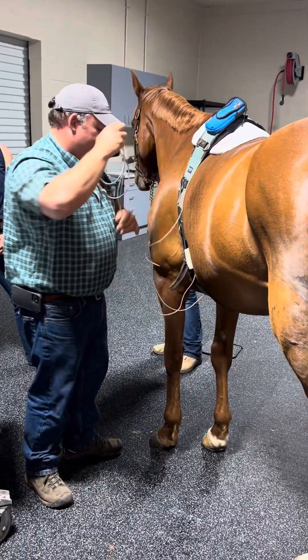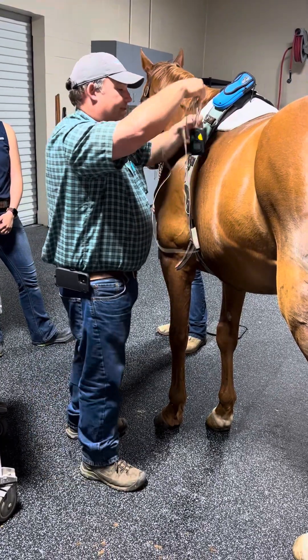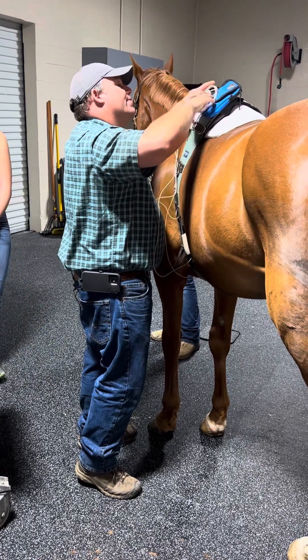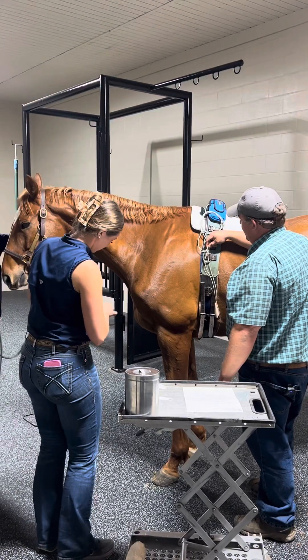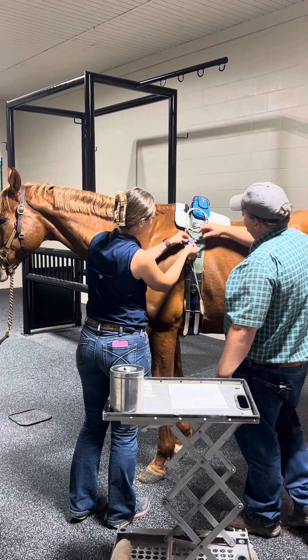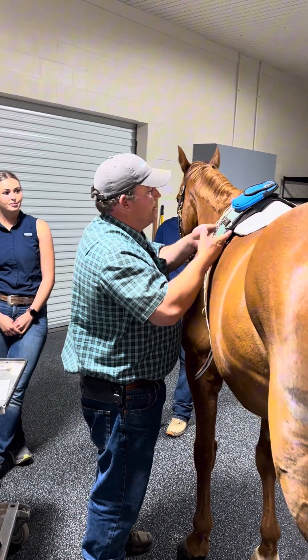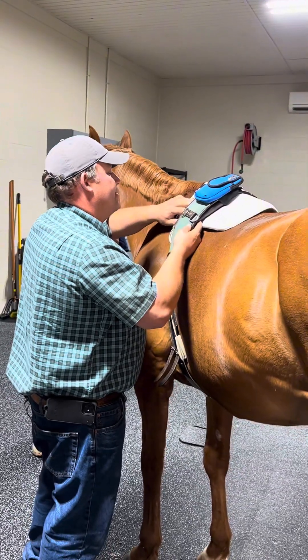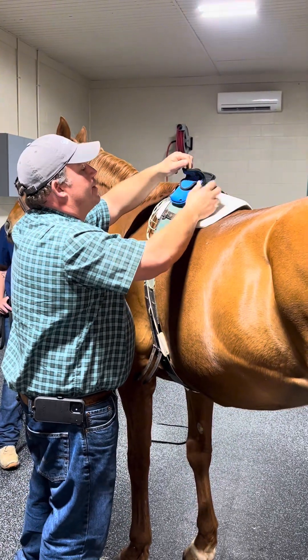Now the SIR surcingle is attached, we've got to do something with our excess wires. So we will simply run these up and place them into the protective pouch on the SIR surcingle. This pocket will be zippered shut. We're just tucking the wires in loosely behind the SIR surcingle — we don't want them to hang up on anything overnight. So we're going to double check our ECG one more time and make sure we are still recording.